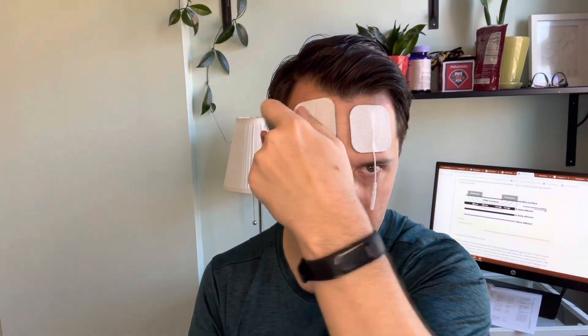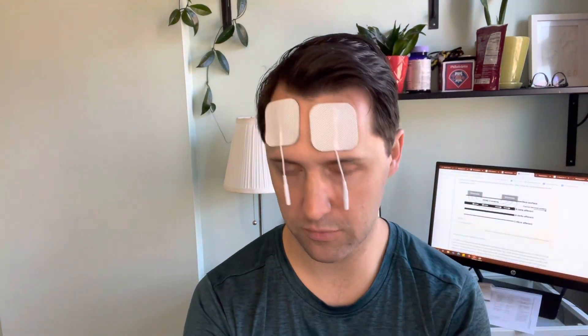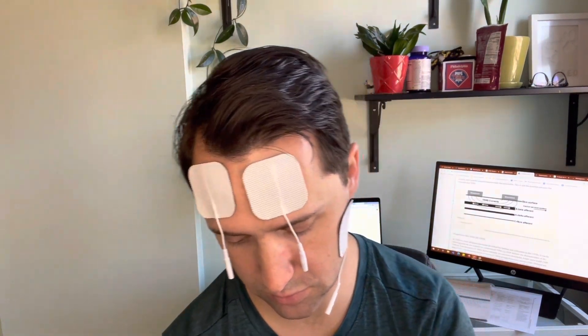The next placement adds on to the forehead placement by also placing electrodes on the cheeks. This is useful if you're having a headache — whether tension headache or migraine — where you're also getting some jaw pain, so it addresses both forehead and jaw pain.